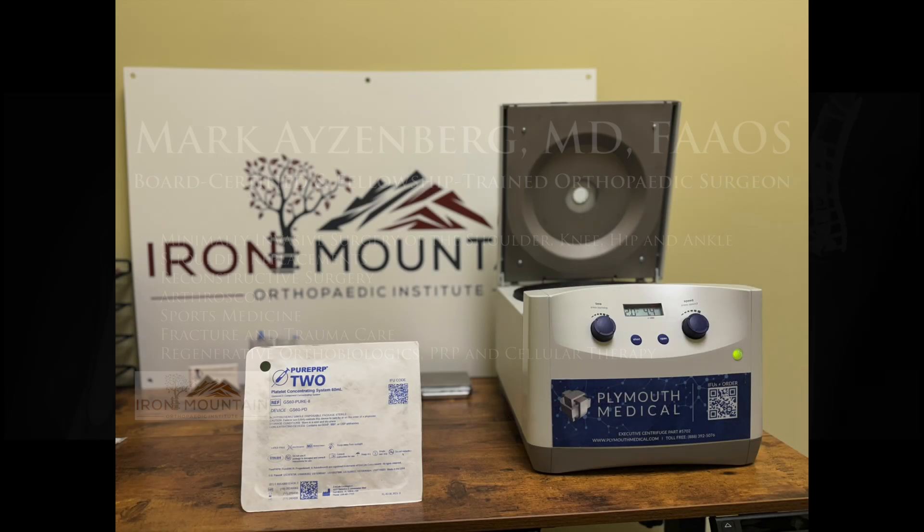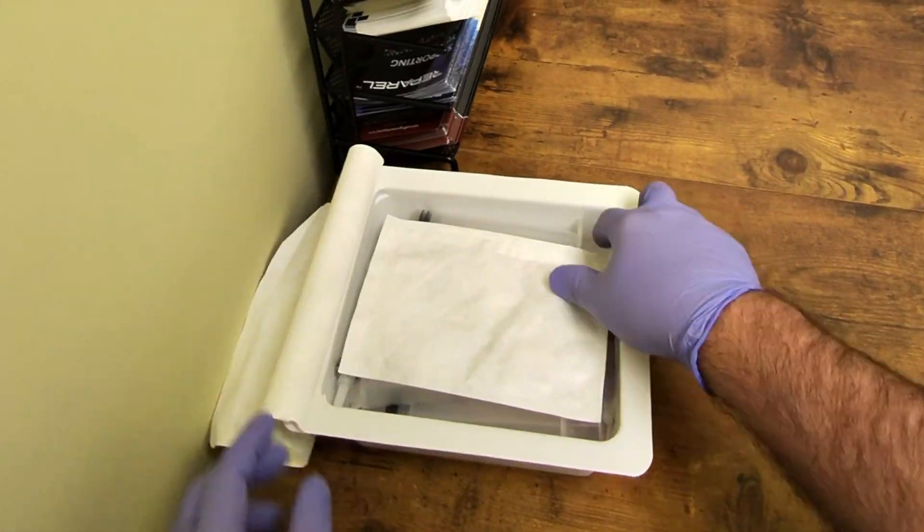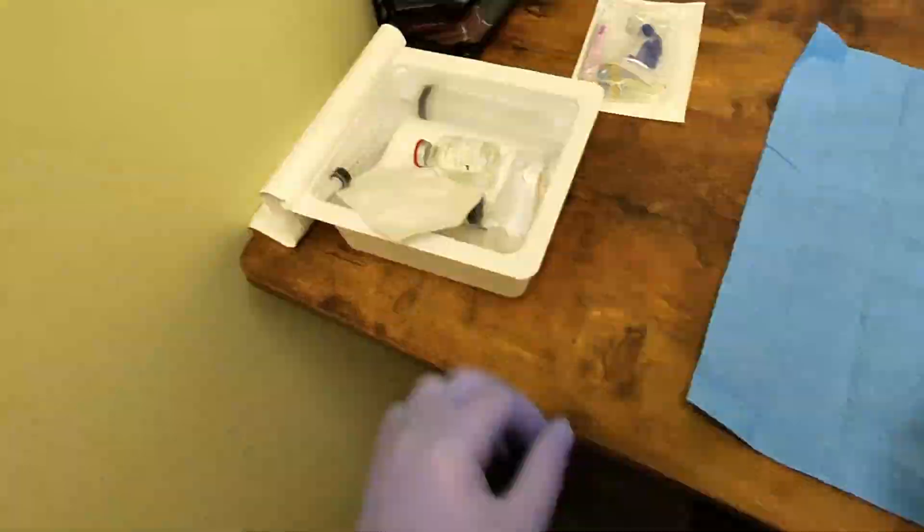This video will demonstrate the procedure for preparation of high quality platelet-rich plasma or PRP using the mSight Pure PRP2 system.